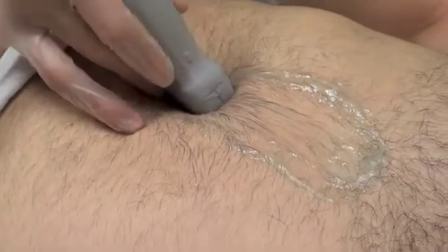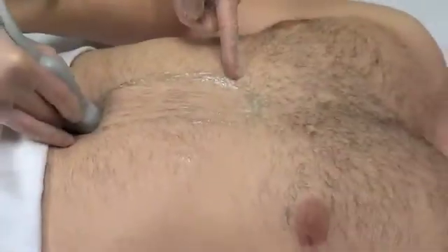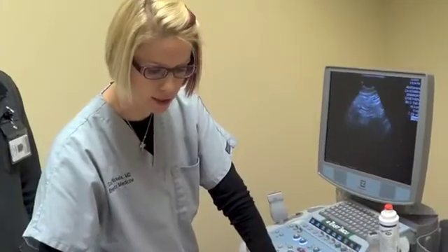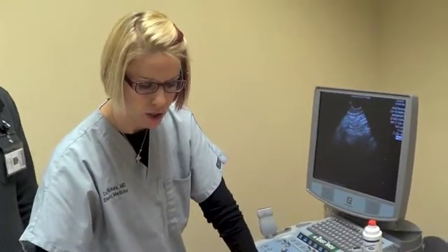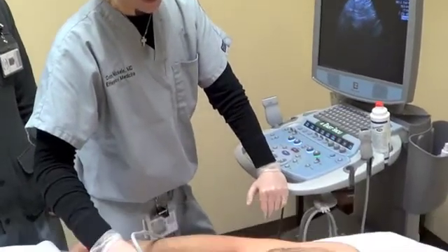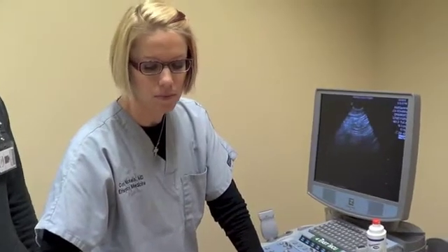You want to make sure you fan side to side. You can also see dissections — you can't rule that out with this exam, but you could see it. I take typically three measurements along the full aorta in longitudinal or sagittal. You want your measurements to be less than three centimeters, because greater than three centimeters is going to be considered an aneurysm. So that's basically aorta.